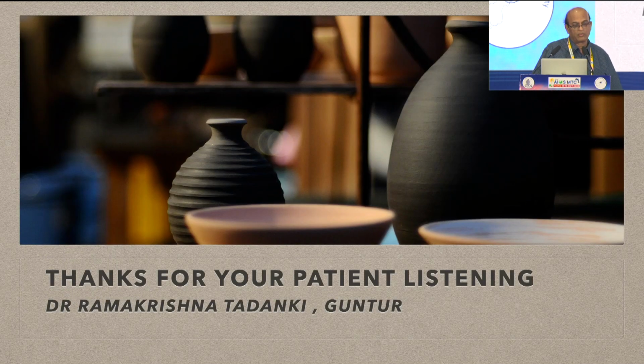So the two most important pearls which I want to again repeat here, number one is the depth of the trench is more important than the length of the trench, and a power modulation. Use a high vacuum and a moderate amount of power instead of using a high amount of power and frying the cornea. Thank you very much.